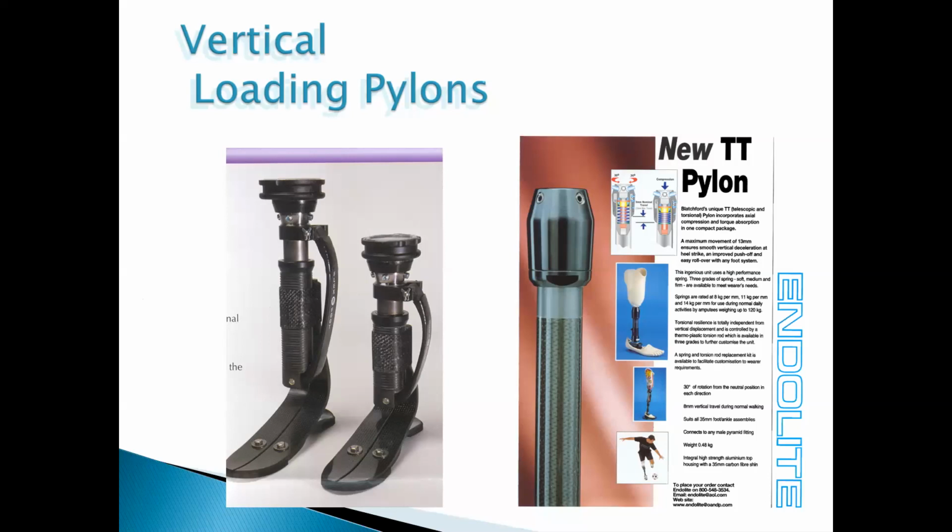And struts have both shock absorbers and springs of some sorts. This is just a torsional spring. Actually, what you usually have in the struts of cars is an actual coil. But the objective is the same, that it has two functions, shock absorption or energy absorption, and then energy storage and return.